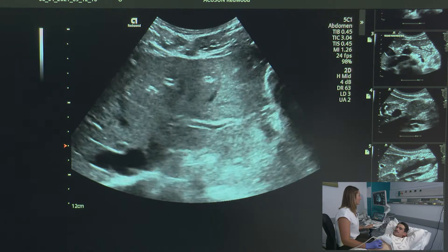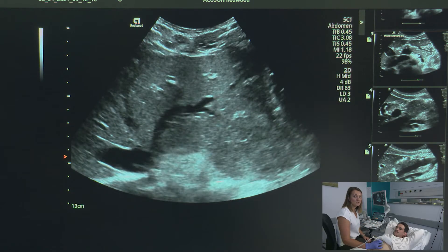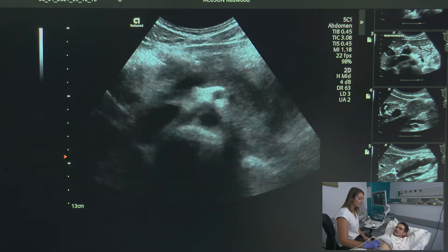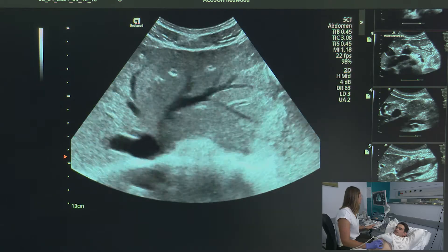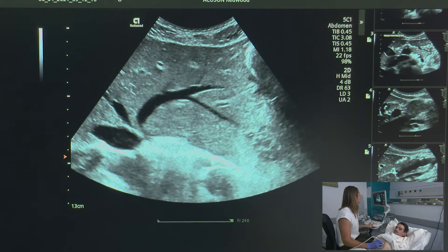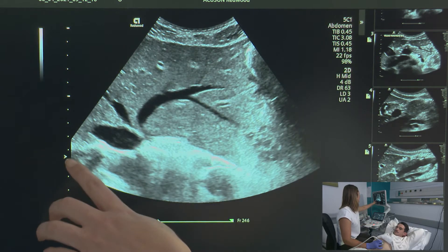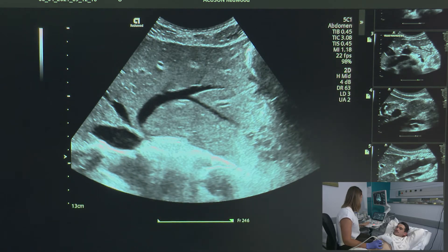It doesn't matter if we take our images first in longitudinal or transverse, but I'm going to start in transverse. Big breath in — hold that breath. The first image I'm going to take is of the left hepatic vein. Breathe normally. I'm making sure that my focus is posterior to the liver. I'm going to annotate: trans, left, liver. And I can acquire that image.